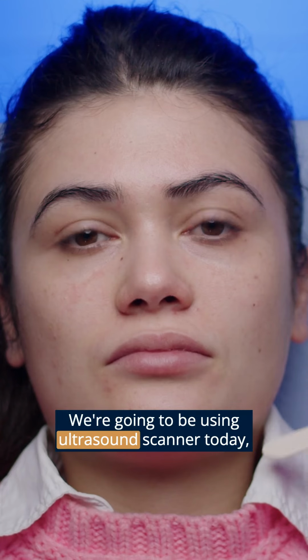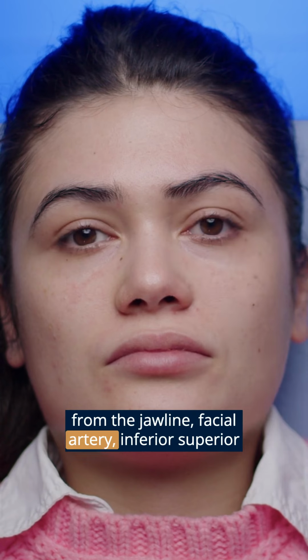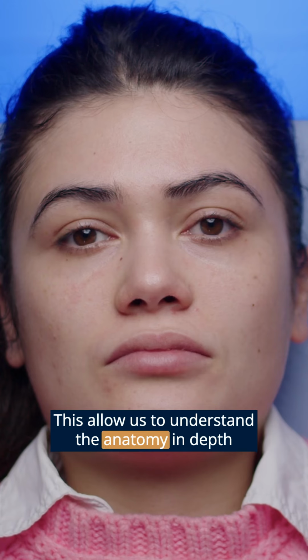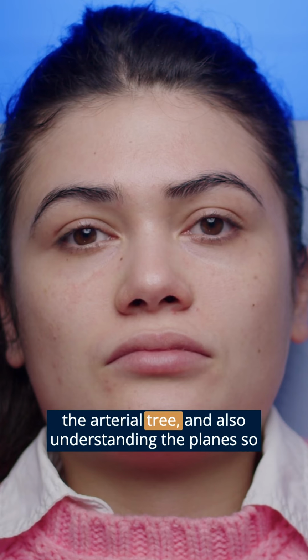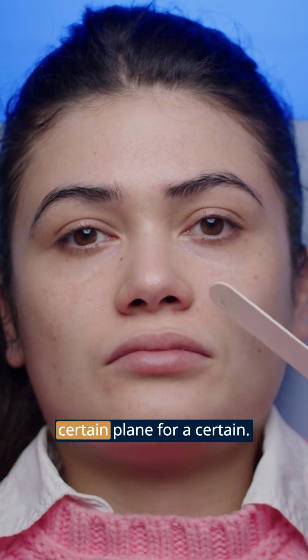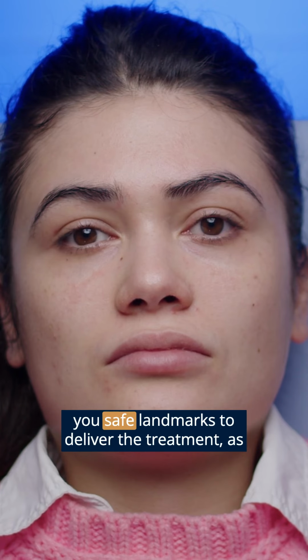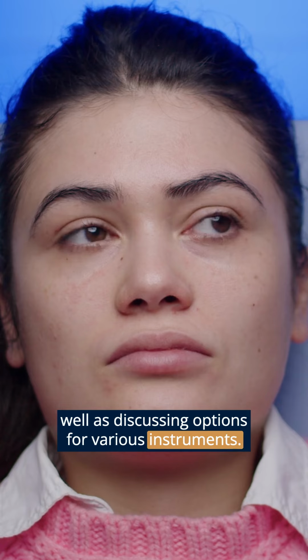We're going to be using an ultrasound scanner today, and this is going to allow us to scan all the vasculature from the jawline, facial artery, inferior superior labials, angular artery up to the lateral nasal artery. This will allow us to understand the anatomy in depth using Doppler mode of vasculature, particularly the arterial tree, and also understanding the plane so we can better understand why we place product in a certain plane for a certain area. I'll be discussing various techniques to treat the nasolabial fold as well as the anterior cheek, showing you safe landmarks to deliver the treatment, as well as discussing options for various instruments.